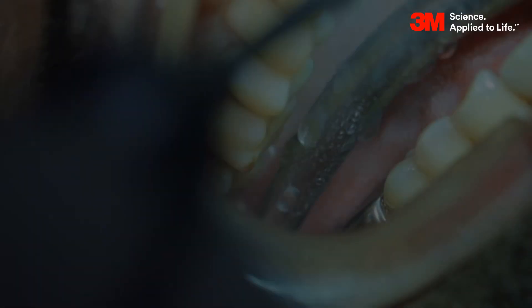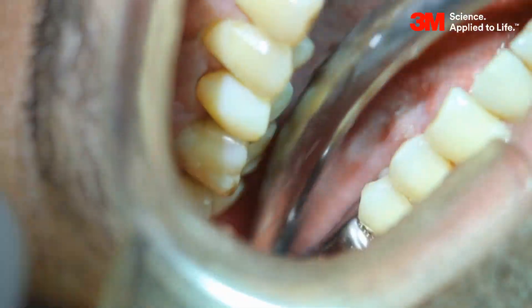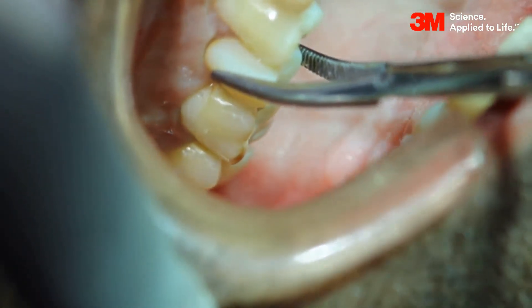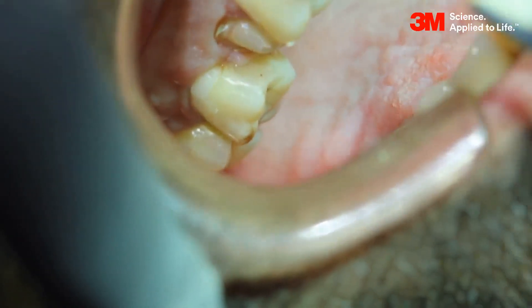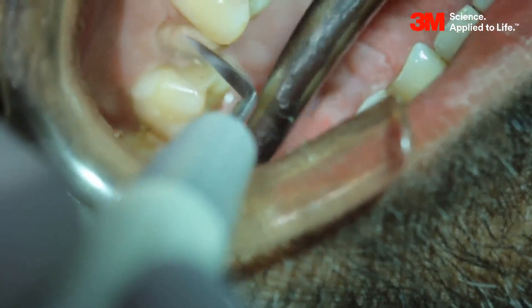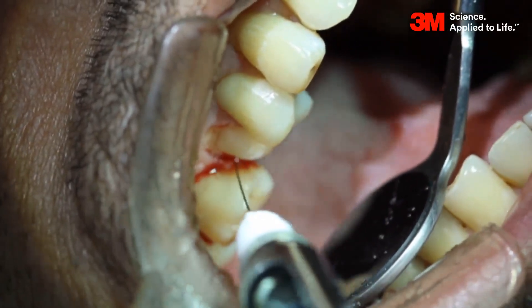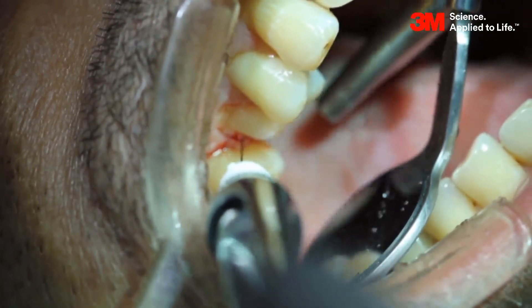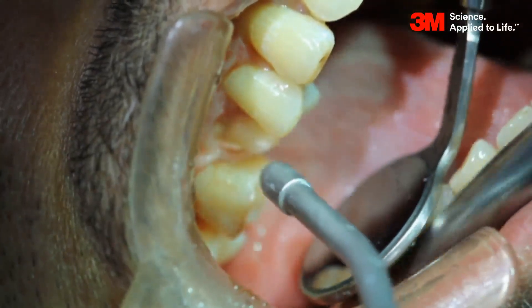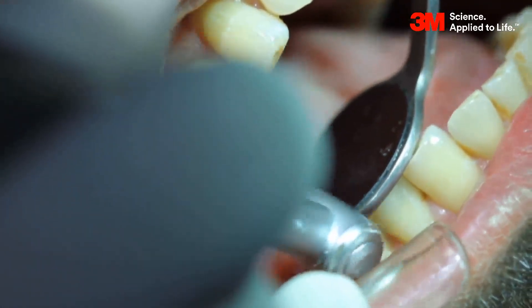Using a three-way syringe, rinse the area and isolate it using a suction tip. Using artery forceps, remove the temporary crown. Use a supra-gingival scaler to remove the excess cement on the prepared tooth structure. After isolating the area, anesthetize it using lignocaine.